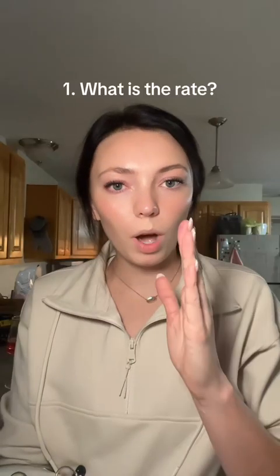All right, so you have your nice and beautiful 12 lead. You have no idea what you're looking at. You're gonna ask yourself 5 questions, okay? The first one, is it fast or is it slow? Is it anywhere from 60 to 100 beats a minute? Is it below 60 or is it above 100?